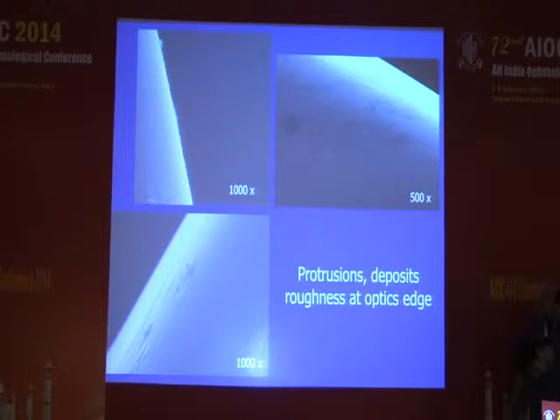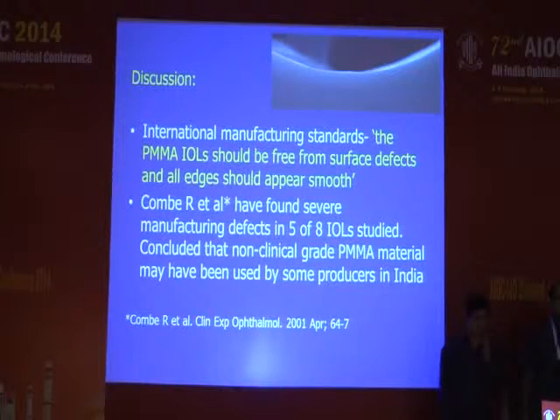At the optic edge, protrusions and deposits and roughness were detected, and these sharp protrusions may rupture the PC during dialing. International manufacturing standards say that the PMMA IOL should be free from surface defects and all edges should appear smooth.